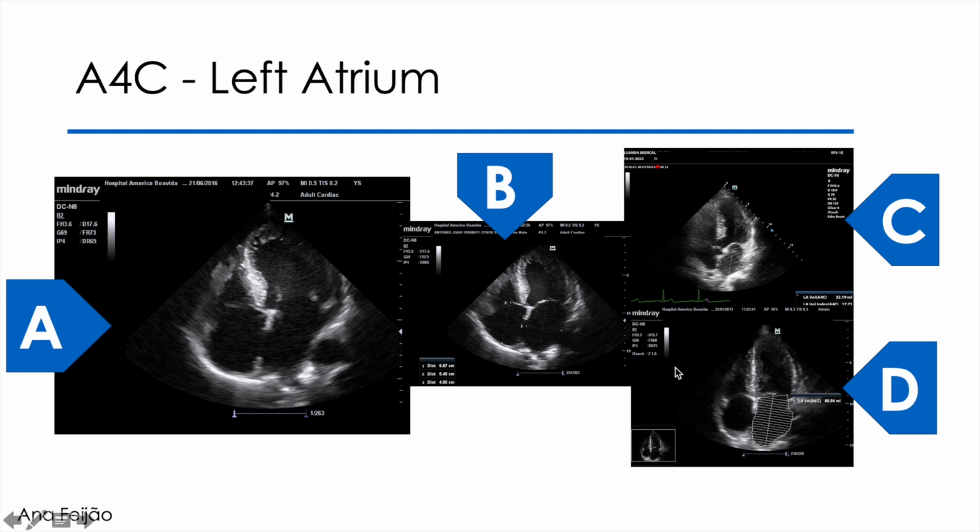Both the area and volume of the atrium must be calculated in telesystole, in the frame just before opening the mitral valve, which means measuring when the atrium is fullest. Okay? And how do we measure these values? Mapping the endocardium of the atrium wall, excluding the area below the mitral annulus, or you see, between the leaflets and the annulus, and the entry chamber of the pulmonary veins.